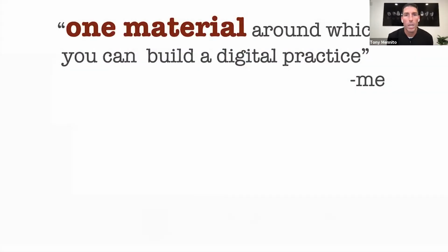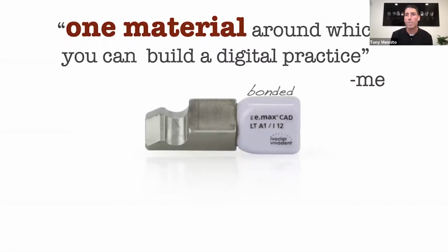We'll talk about that. But for me, there really is one material that you can build a digital practice around, and it is emax. And it is more specifically bonded emax. We'll talk about that a little later. But I bond almost all my emax into place. I have a certain philosophy that revolves around doing really conservative dentistry. So I do crown preparations that don't have much in the way of retention and resistance form, where I'm really relying on bonding of that ceramic to the tooth structure for retention.